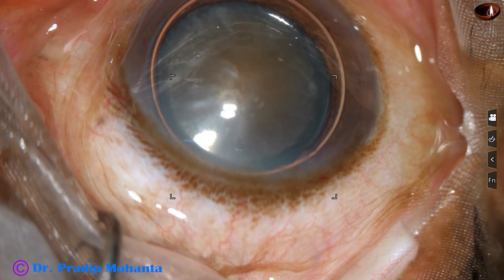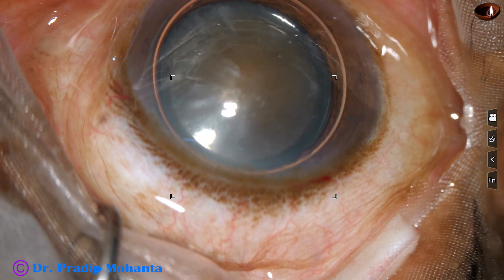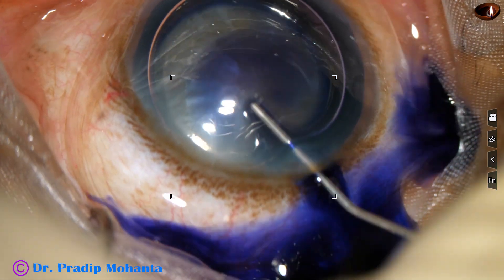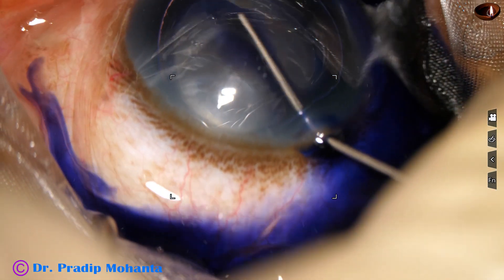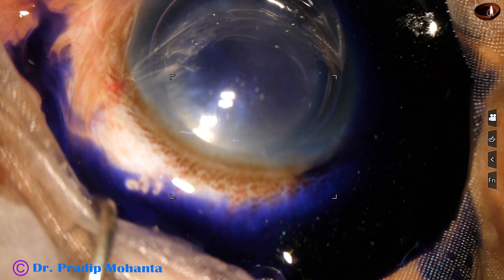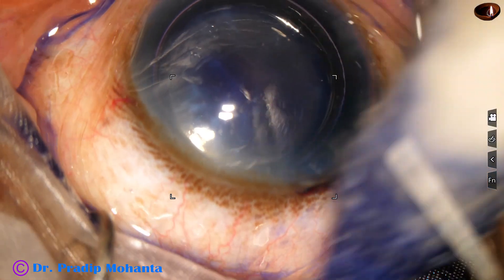An air bubble is injected into the anterior chamber and then trypan blue dye goes into the anterior chamber. The dye is sprayed uniformly all around to get uniform staining of the anterior capsule.